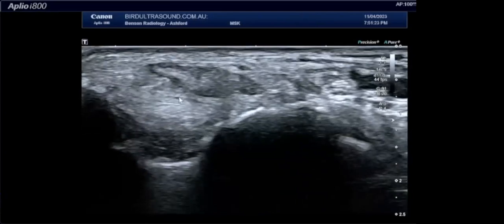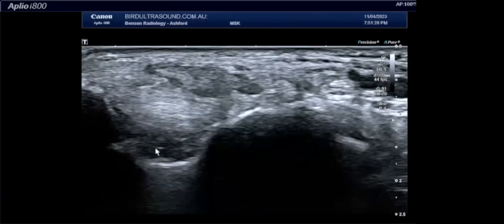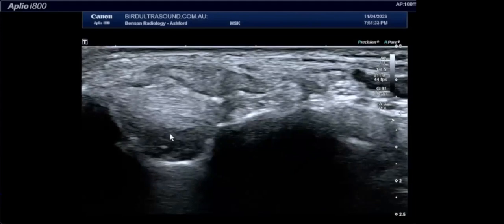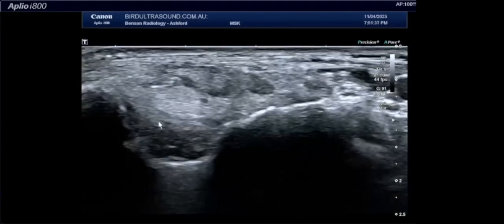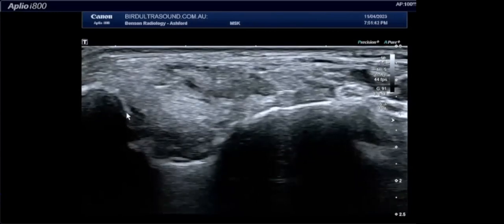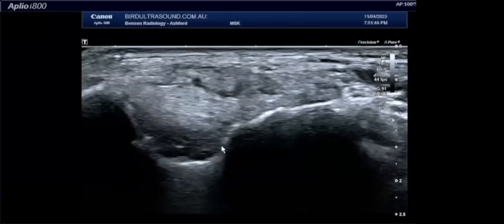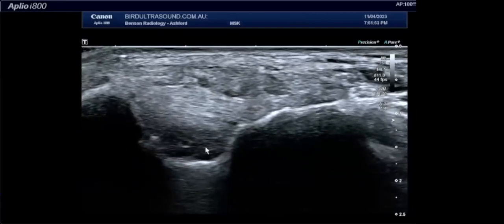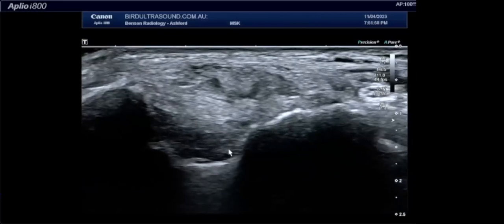And you can see this very thick external layer here that's nearly pure collagen. And underneath that, you have a more striated, slightly fatty layer, also striated with synovial material, which is part of the deep part of the capsule of the deltoid ligament. What I'm looking for here is a couple of things. The first thing I'm looking for is any collision fractures. So when the medial malleolus collides with the medial border of the talus as part of an inversion injury, you can then generate small collision fragments where small pieces of the talus or small pieces of the medial malleolus become dislodged, and they'll sit in this location here.